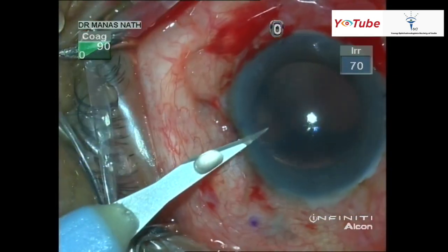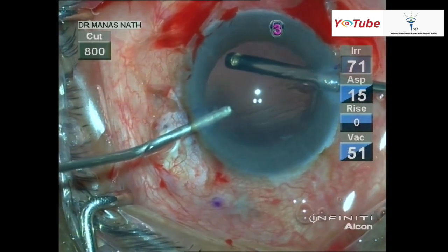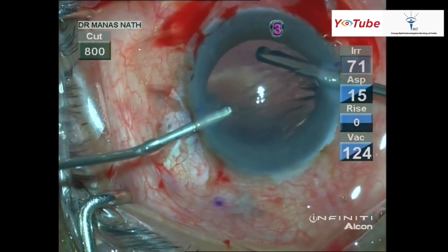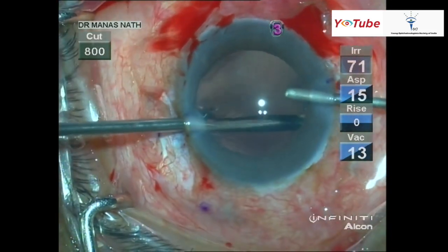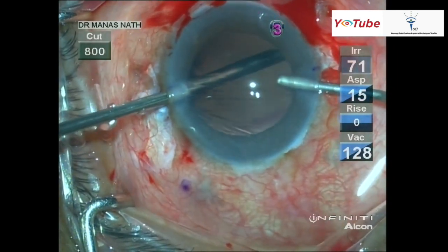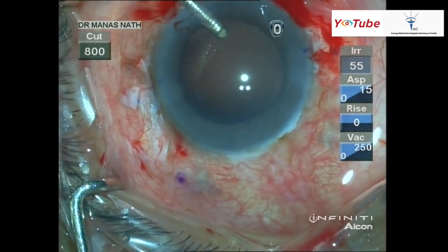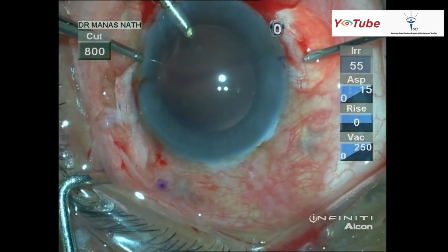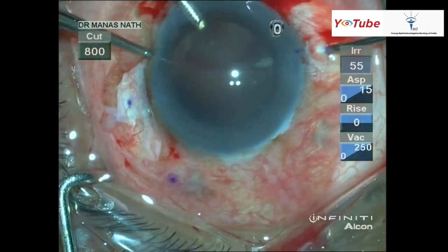I usually prefer to make three side ports: two for the vitrectomy and one for the AC maintainer. A thorough vitrectomy should be done, especially below the iris and where the sclerotomy is being done. Then the AC maintainer is placed. I'm doing the sclerotomy with a 24 gauge needle.